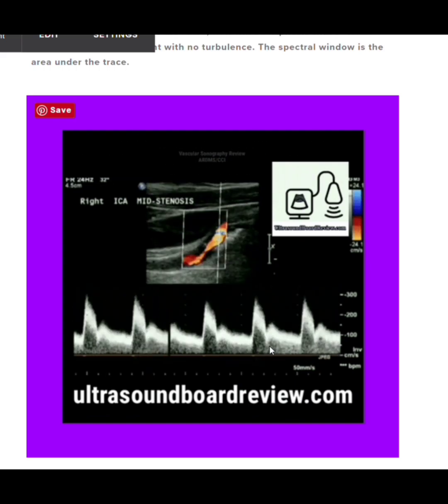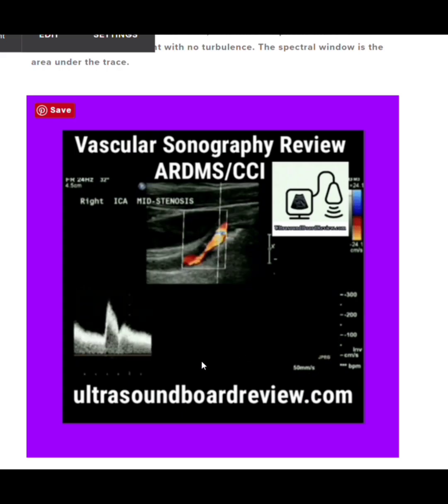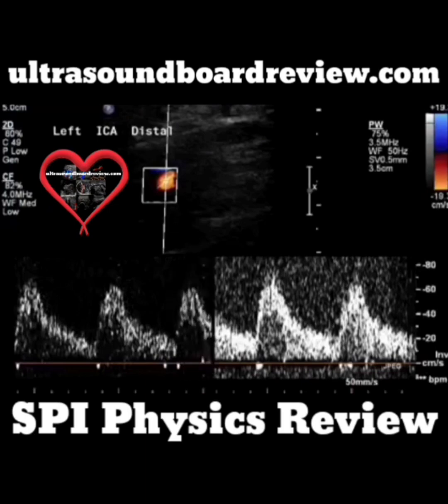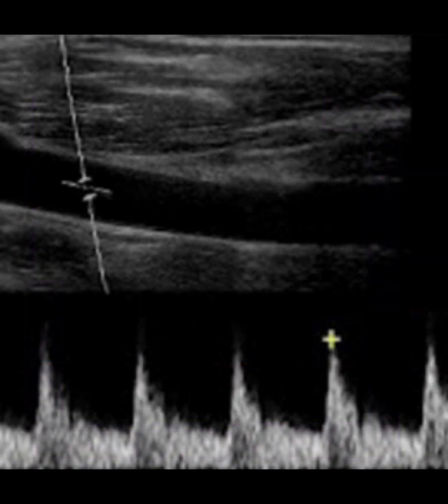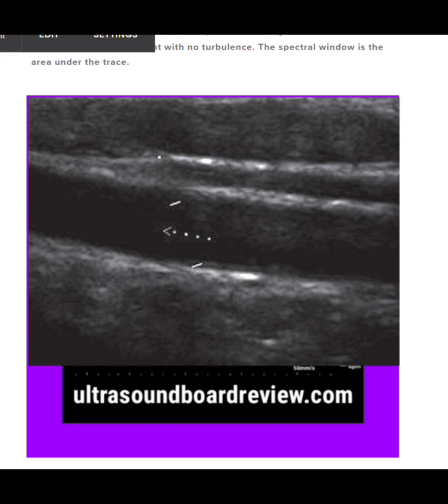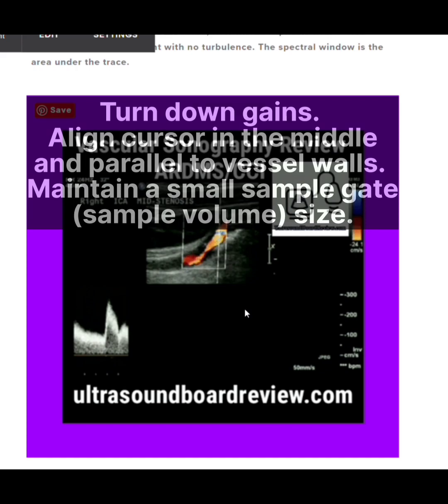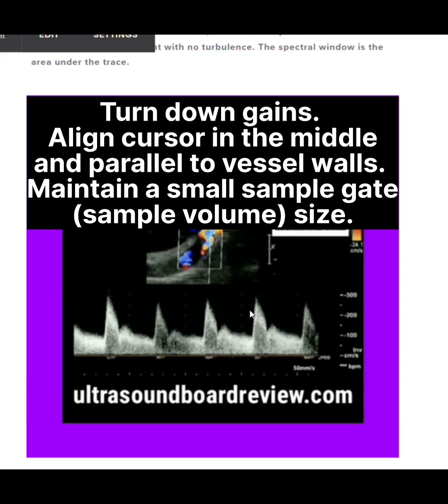If you see spectral broadening with disease present, that means all the flow in that area is turbulent. If you see spectral broadening in a normal vessel, check your gain first — turn it down to eliminate filled-in echoes. Then check your angle and align your cursor parallel to the vessel in the middle. Finally, check your sample gate volume — the sample gate picks up velocities through the vessel and should be kept small.